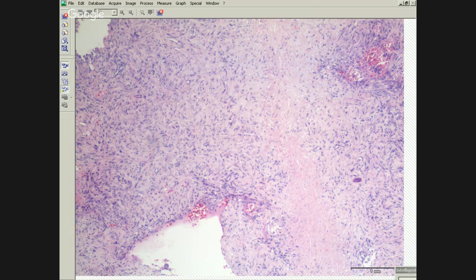That's because when you have this type of morphology, your differential is primarily with sarcomatoid carcinoma or other sarcomas. So even though sarcomas can mimic the distribution of mesothelioma, particularly the epithelioid vascular tumors, most spindle cell sarcomas are going to present as a mass, or they're going to be metastatic from someplace else, with an exception we'll show in a minute.